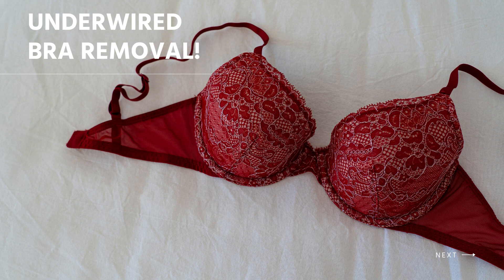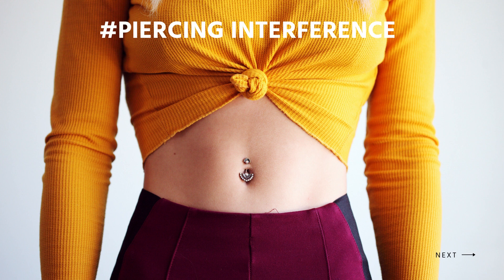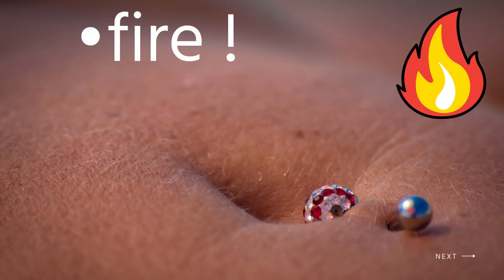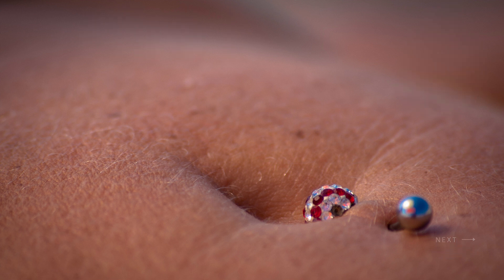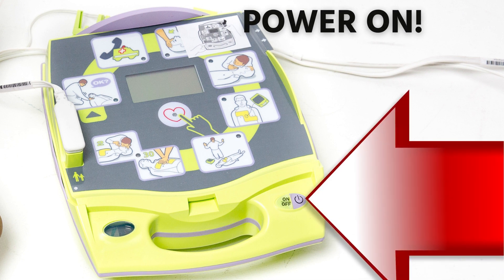Remove her bra if it has a metal underwire. If there are metal piercings on her torso, remove them before using the AED to avoid possible interference, as use of a defibrillator on a woman wearing an underwire bra may predispose to arcing or fire. Use the included razor for shaving her chest if it is very hairy.